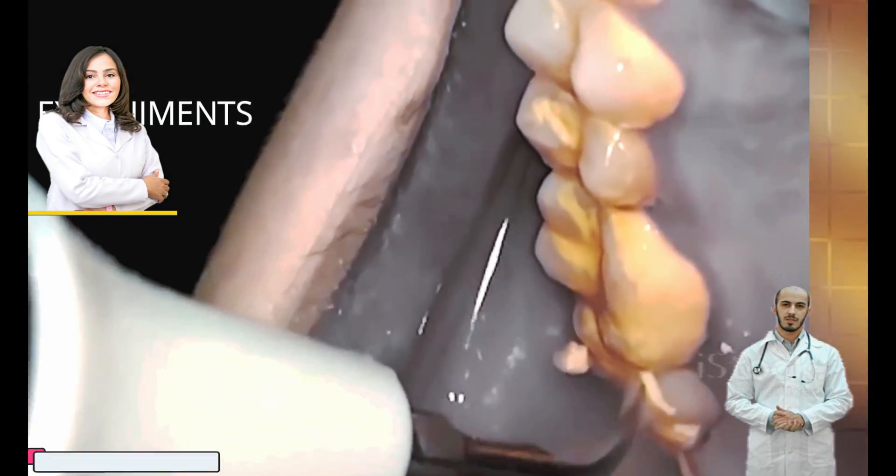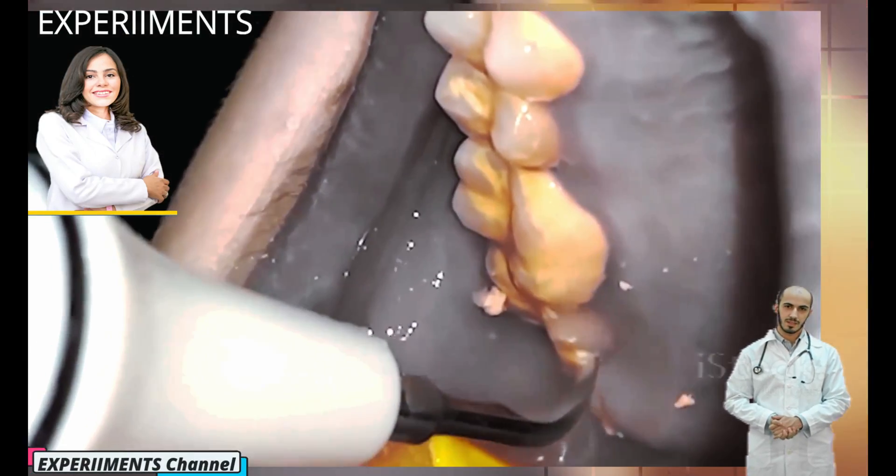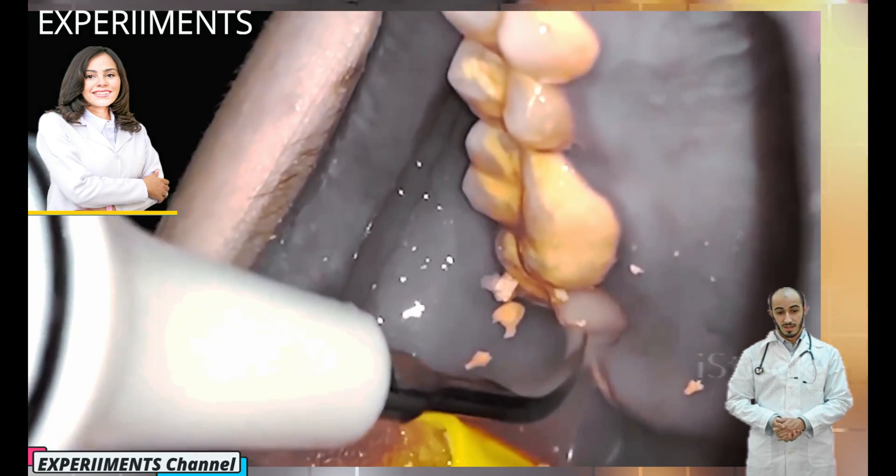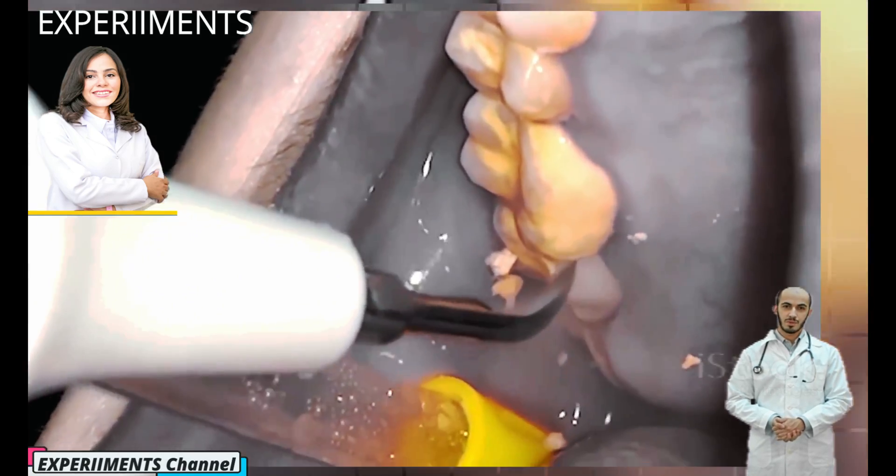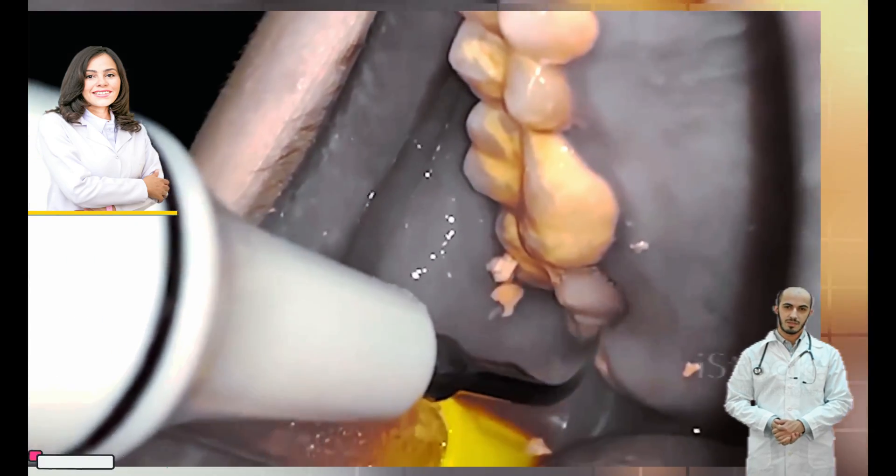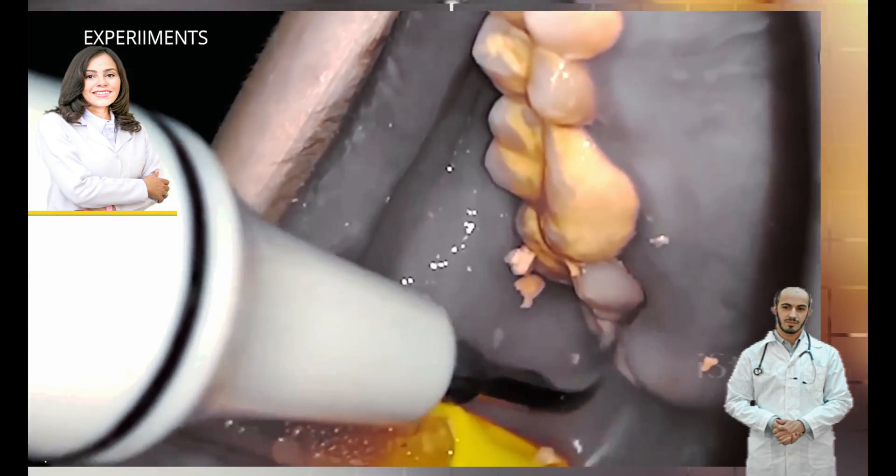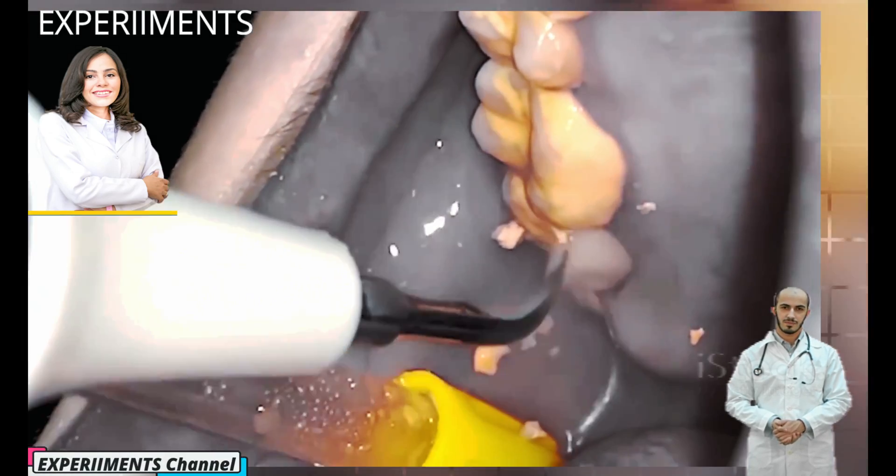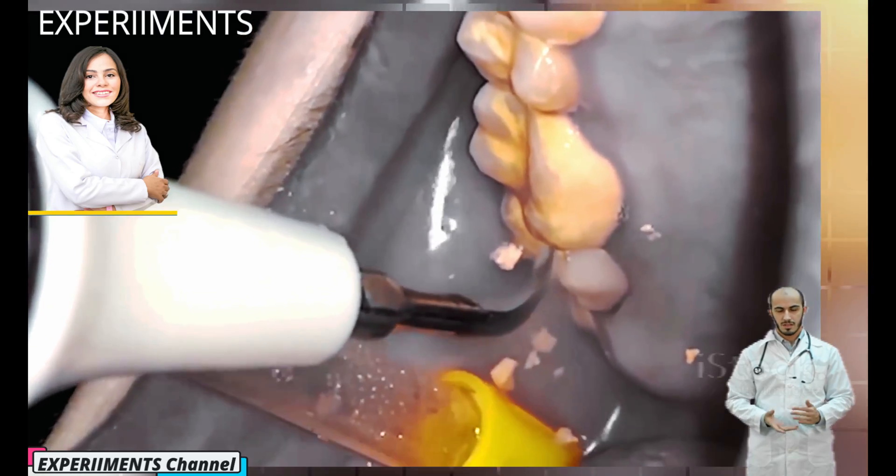Hi everyone and welcome to the channel. Today is going to be really interesting. I'm going to show you a patient that has tartar that honestly I've never seen before. It covers her entire teeth. Now I can't wait to show you how we're going to change this person's life just by removing the tartar. She can actually start feeling comfortable when she eats and speaks.